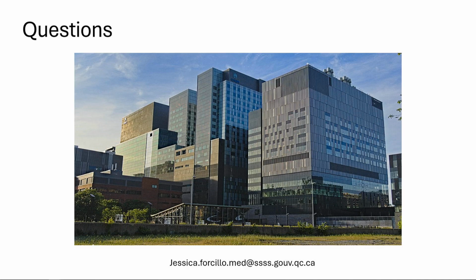What about female patients, given the recent controversial studies? When we look at the small annulus, we're very aggressive. In my surgical practice, I do annular enlargement in maybe 80% of my patients, because we are performing root enlargement during surgery. So it's not something that would favor one or the other.